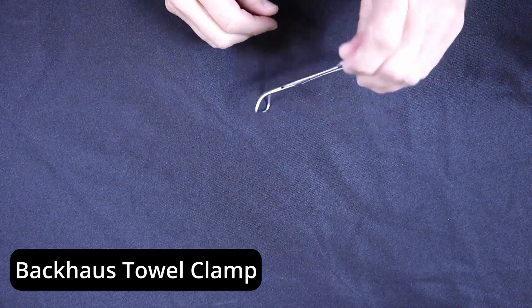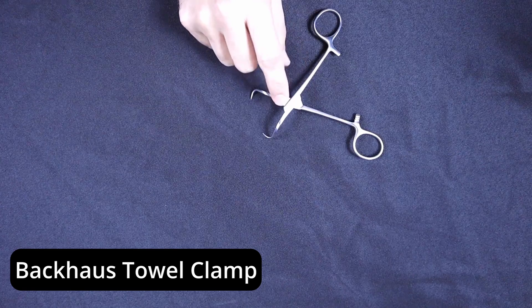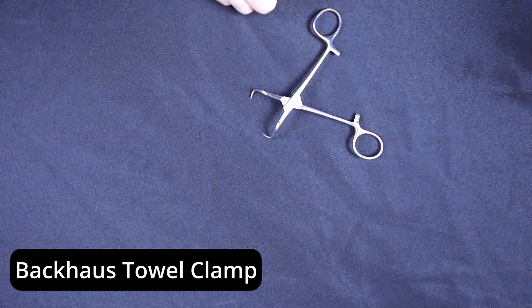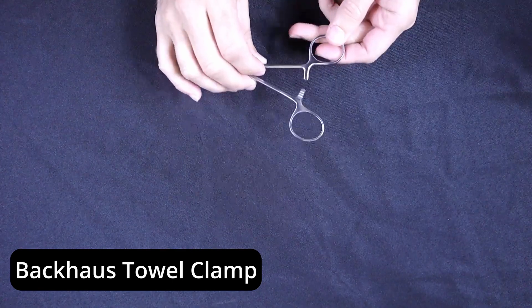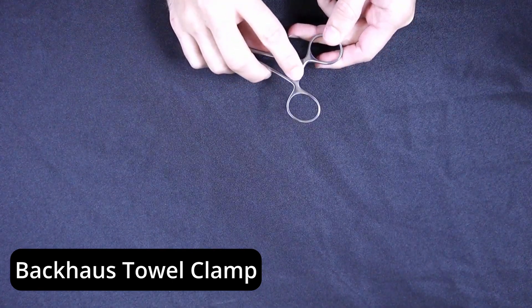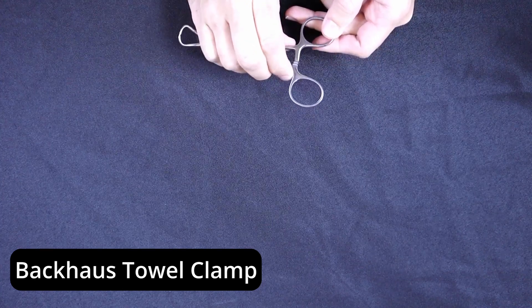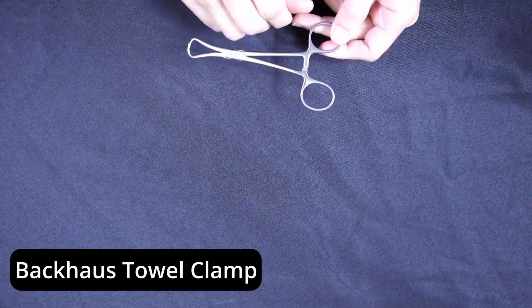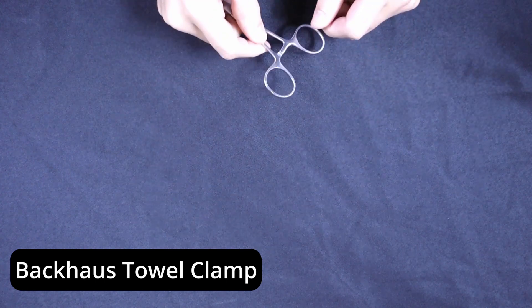As with any of our hinged instruments, you're going to want to make sure that you're inspecting in the hinged area for any bio burden or residual debris. And as always, if you do have a ratchet on the end of these ring handles, you're going to want to make sure that the ratchet closes appropriately and stays closed. You can do the little tap test on the table to make sure that that happens.